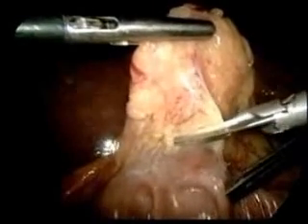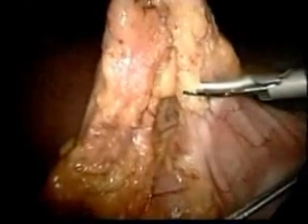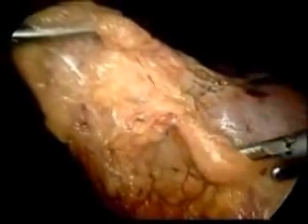Bipolar shears or hook cautery can also be used, but caution must be taken in preventing the current from injuring the colon. The plane of dissection is usually quite obvious, but in states of inflammatory bowel disease or previous colitis, the plane might become obscured.